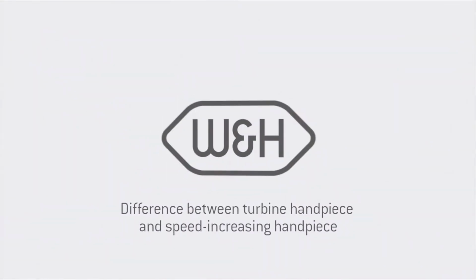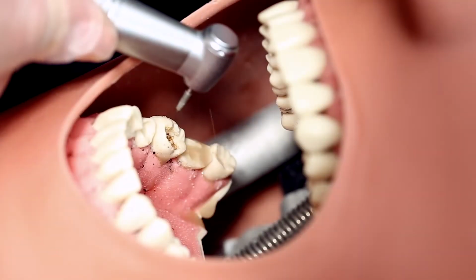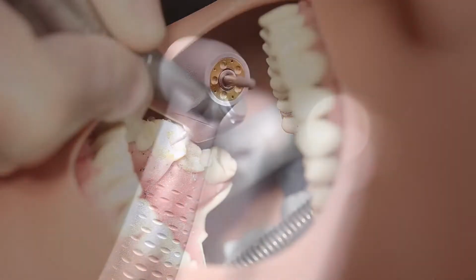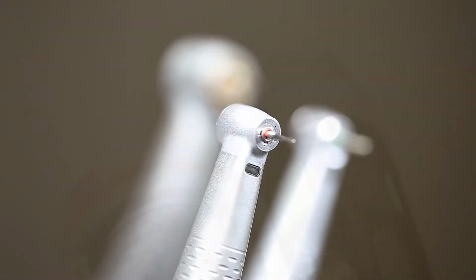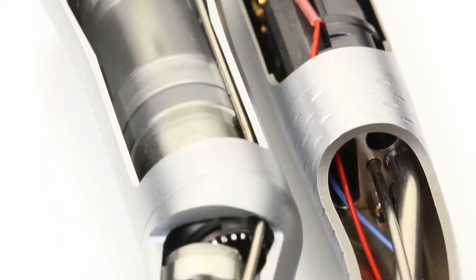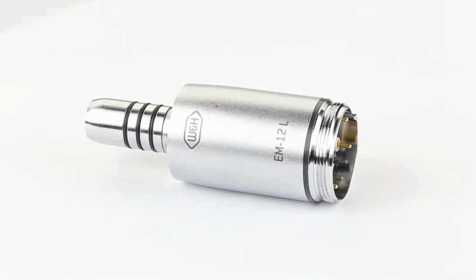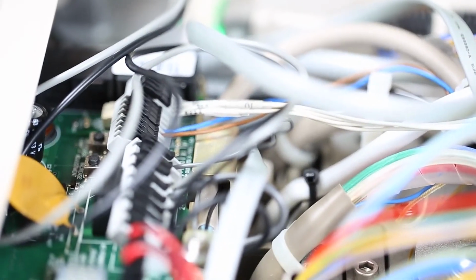Difference between turbine handpieces and speed-increasing handpieces. Whether air-driven dental turbines or red high-speed contra-angle handpieces are used for preparing enamel and/or dental prosthesis materials depends on personal requirements for ergonomics and efficiency. Air-driven dental turbines are more lightweight than red contra-angle handpieces, need no additional motor or control, and require less investment.